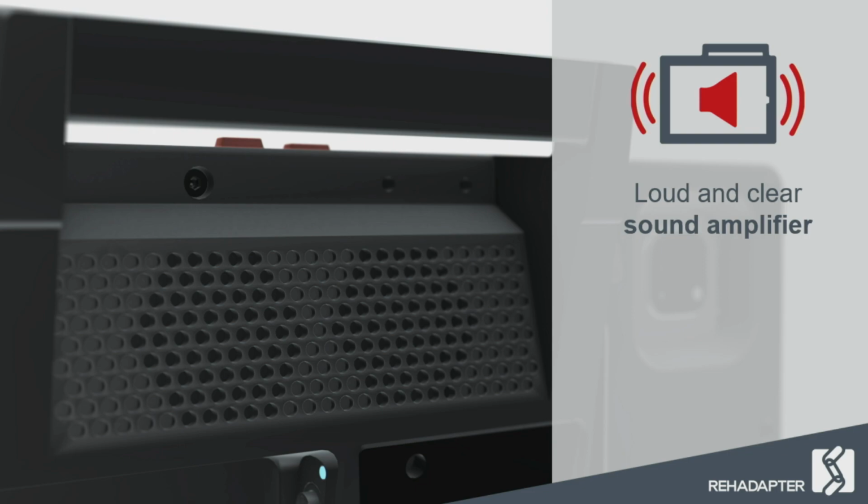So it doesn't matter if the customer would like to adjust the volume from the front or the back side, they are always accessible. The speaker has been optimized in an audio lab for maximum performance when the Rehadapter is lying flat on a table or when it is mounted on one of our mounting solutions, for example. That's one point.